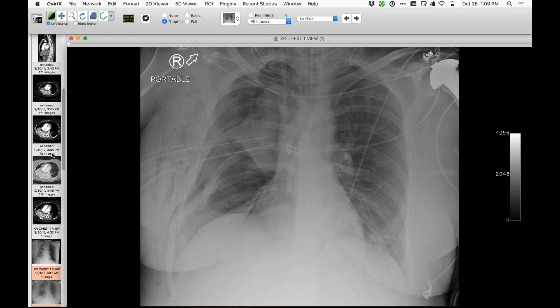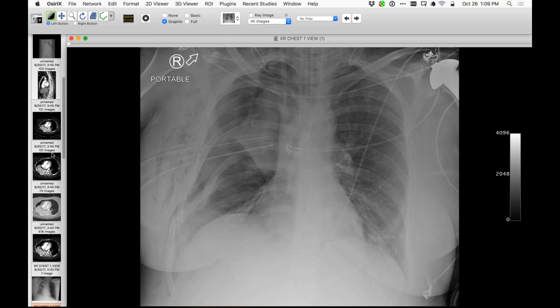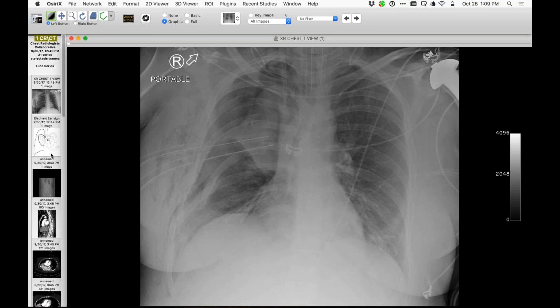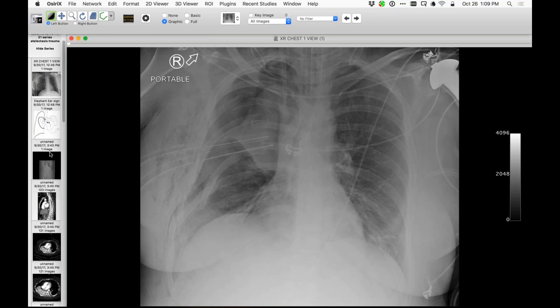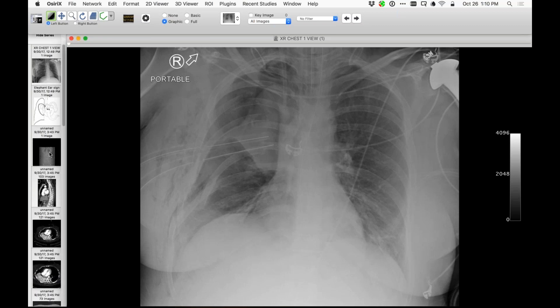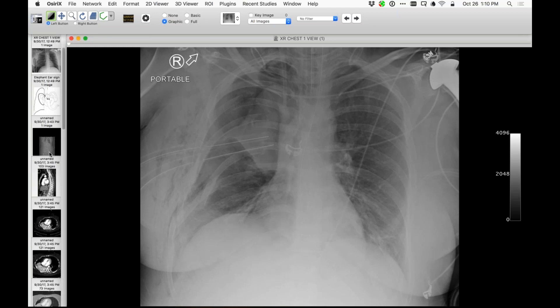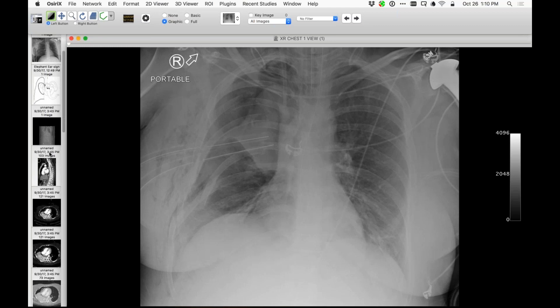That combination of right upper and right middle would be unusual, because the bronchus intermedius is spared. So when you see descriptions of that, usually they say one bronchial obstruction might be a mass, but the other one is something different — for example, secretions or something like that.